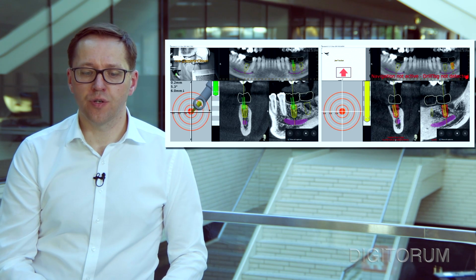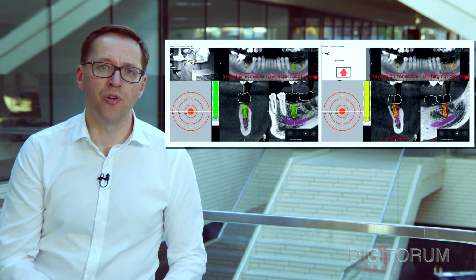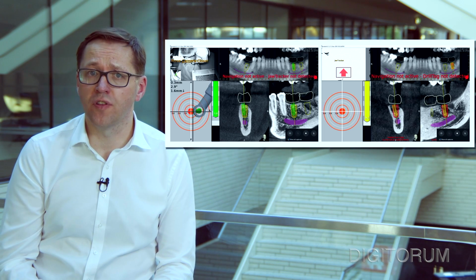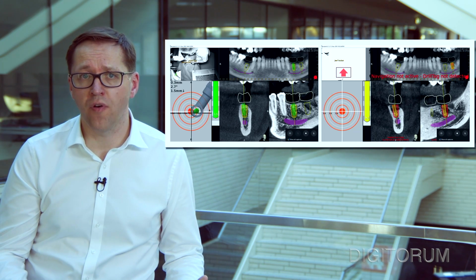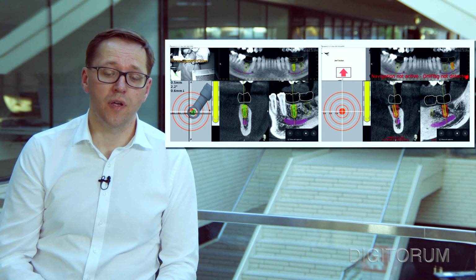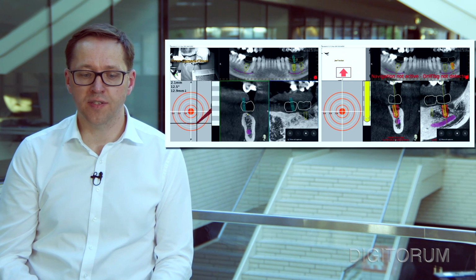Well, the disadvantage in my eyes is that with a static surgery we can communicate better in the prosthetic phase, and we can also connect better with producing some prosthetic components before the surgery, custom abutments or temporary restorations. But anyway, this offers a nice advantage for the clinician and great flexibility.